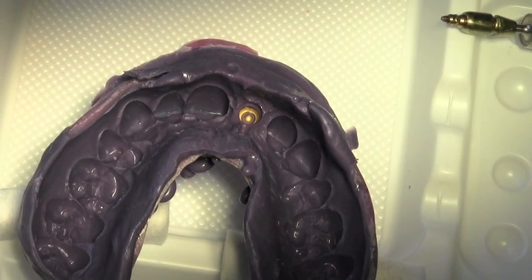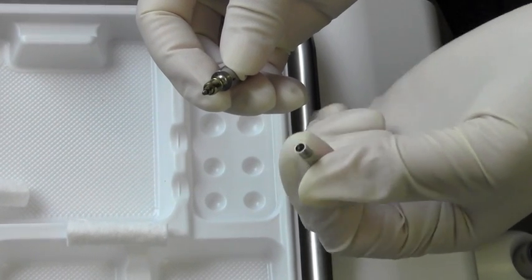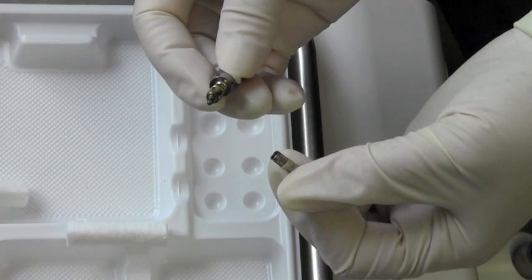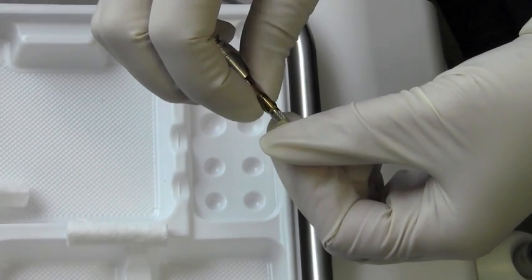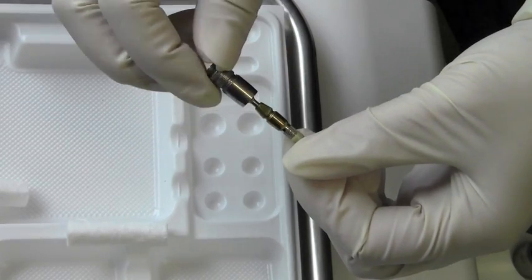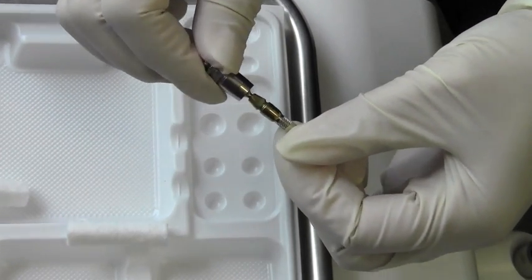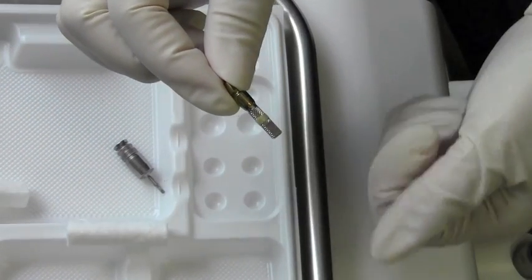What Lisa's going to do is couple up the impression post to the analogue and reinsert it into the impression. Lisa now has the 3.8mm analogue and the 3.8mm impression post, and she's going to couple the two together using the 1.22mm hex driver. This is going to simulate the relationship of the impression post to the implant in the mouth.